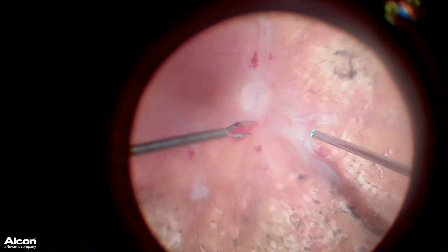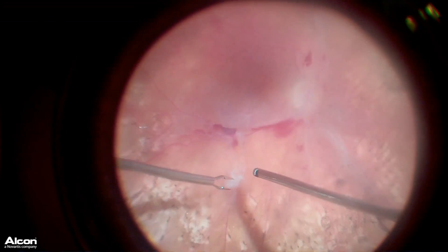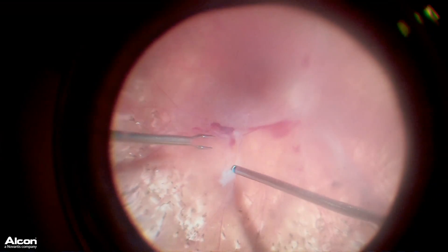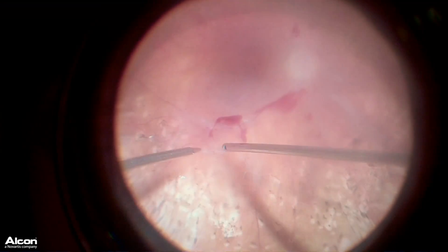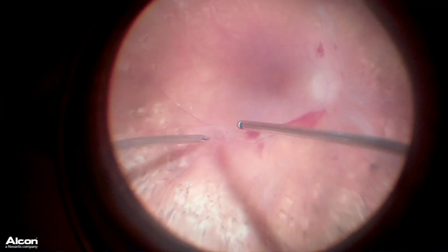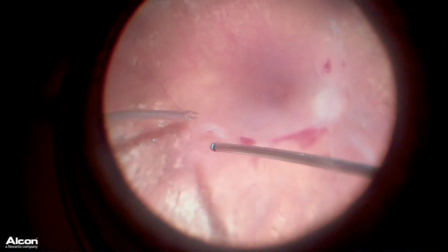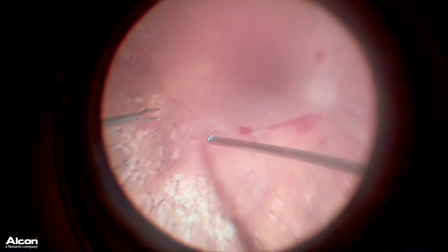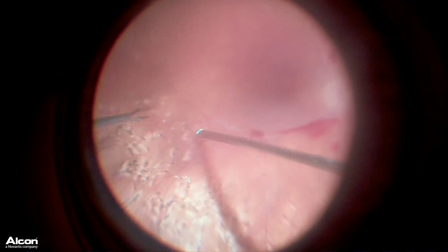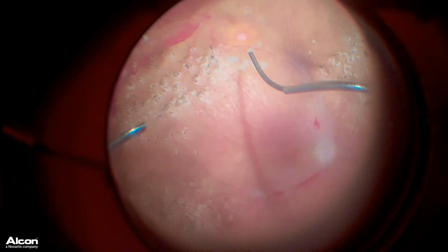This allows very efficient removal of the scar tissue, and being able to look behind this scar tissue as I'm cutting it is simply invaluable. There is a little bit of a transition or learning curve to using your left hand — it's unusual that we as surgeons don't typically use our non-dominant hand as often as we probably should. But doing this type of surgery really gives us an advantage in the efficiency and safety of removal of this scar tissue, and truly benefits our patients.